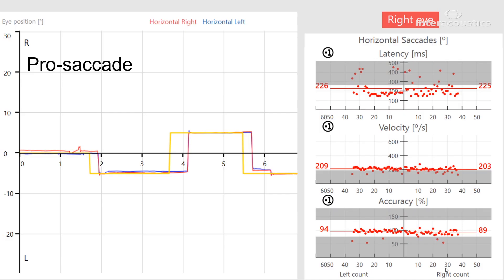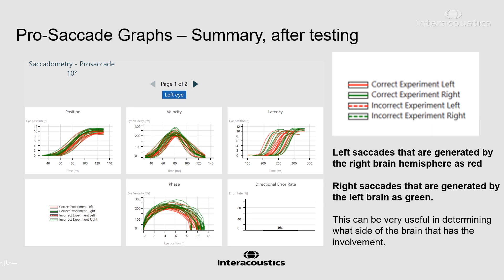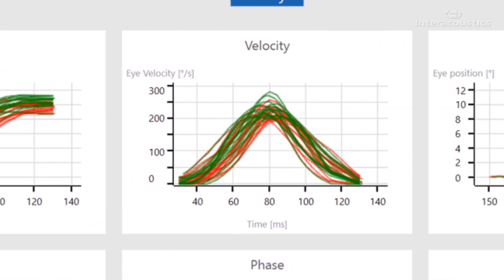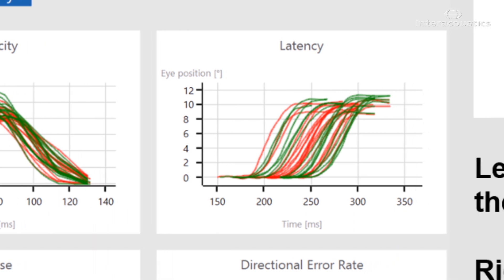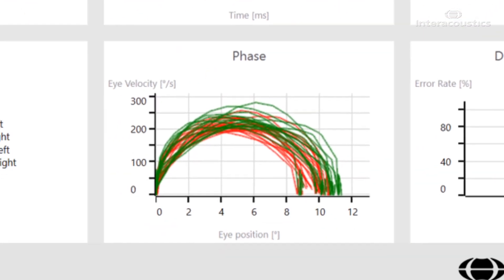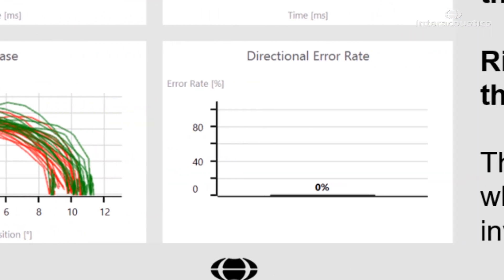Within a pro-saccade graph, we're seeing measurements looking at the latency, velocity and accuracy of eye movements moving towards the target as it changes position. The summary data is more detailed: we have information on eye position, velocity behaviour of the eye rightward and leftward, latency distributions relative to eye position over the time base, acceleration and deceleration of the eye as it changes position, and finally directional error rate.